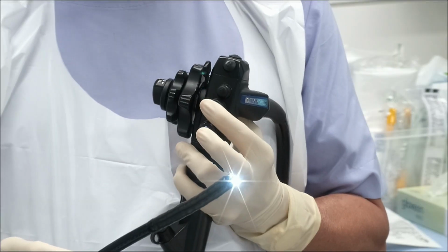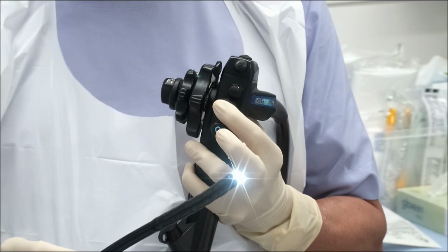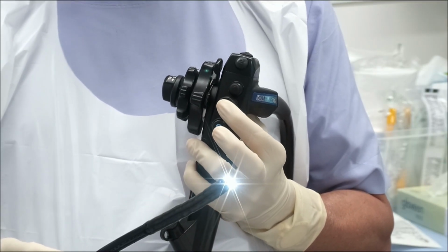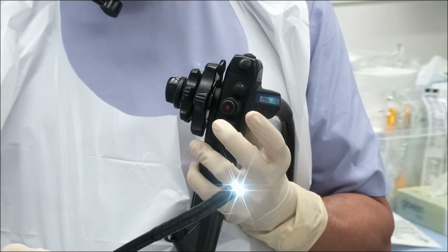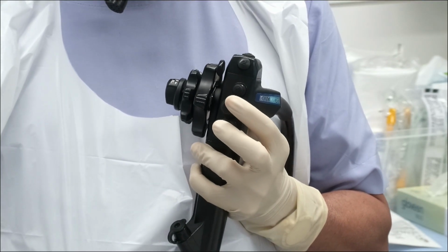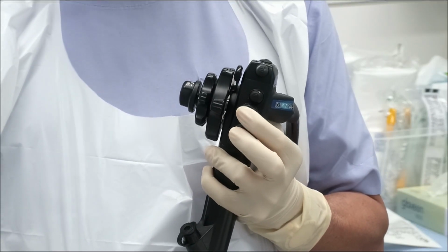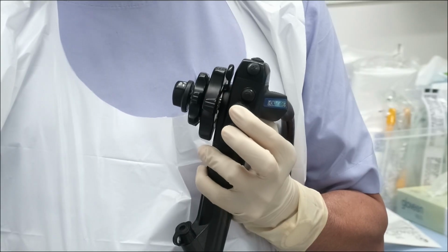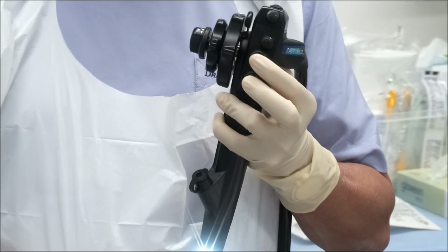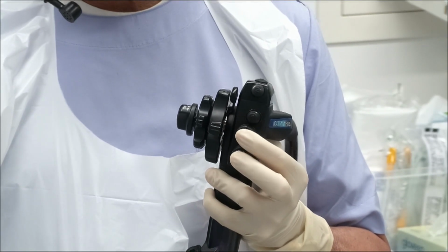Now, when you just put your finger on it, nothing happens, but for activating the suction, you have to press the button. Normally we just keep the middle finger on the air, which is continuously coming out, whereas you can see your index finger is kept on the upper button. It is just placed over there, and once we are inside, if you want to suck some fluid, you have to press your index finger, by which suction can happen.